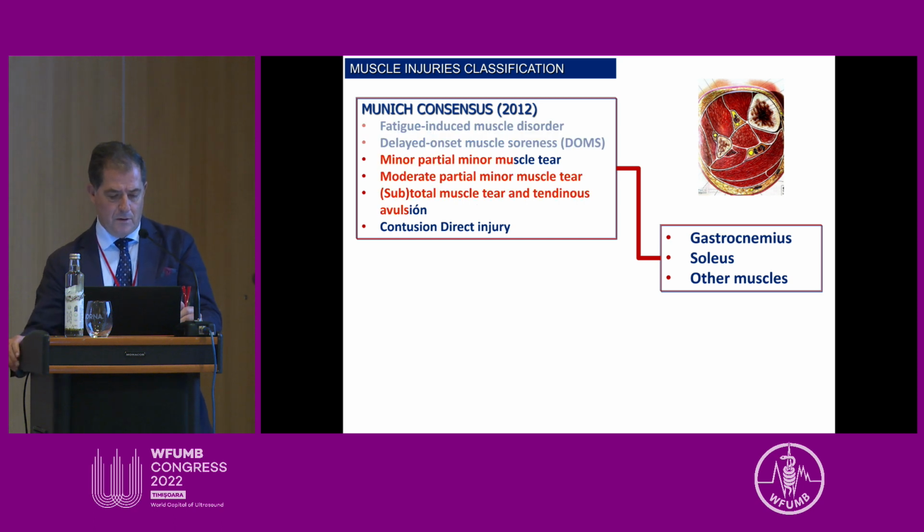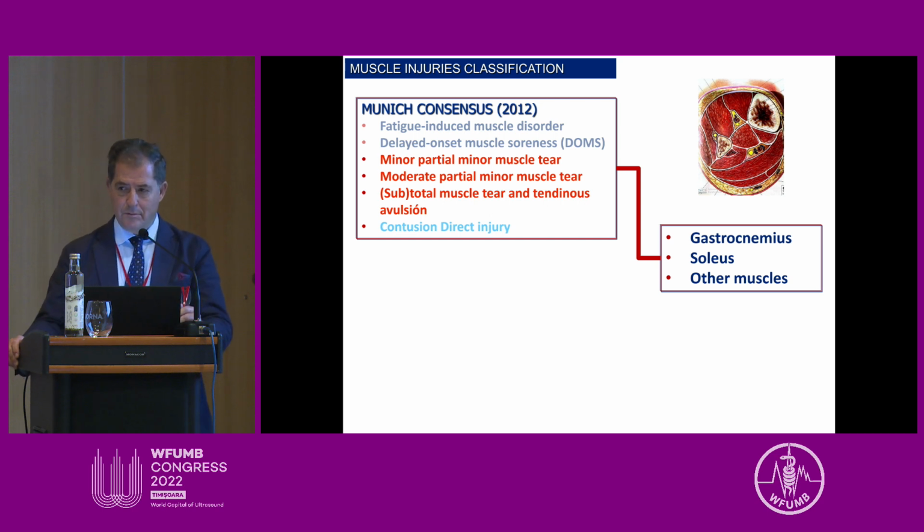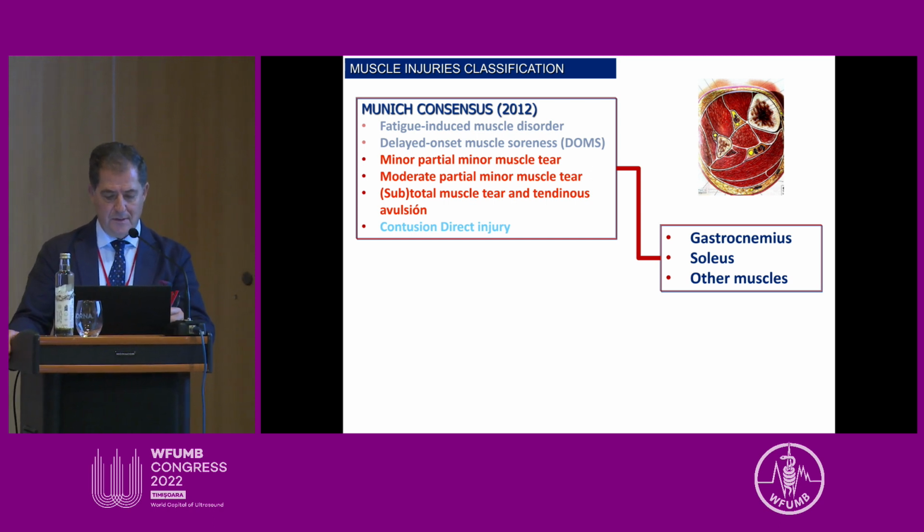We distinguish one kind of injury without histological changes: fatigue, DOMS. Other kinds of injuries affect the fibrillar tissue, and so we can see them perfectly by ultrasound. The minor partial rupture is complicated because sometimes the changes in the B-mode exam are smaller, and so in elongation or distension the diagnosis is hard.